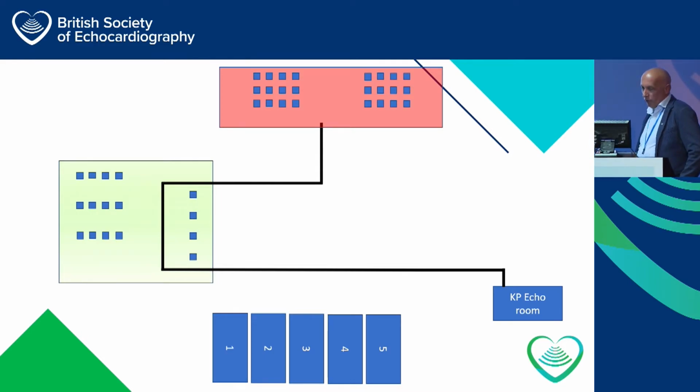Keith tells his patients to sit in the main outpatients here, and I purposely make them sit down here at this bottom right. It's kind of like a creature of habit. It's just something I've always done, but I sit them bottom right. And the reason for that is because my echo starts when I start to move towards the patient, not when I walk in the room here.